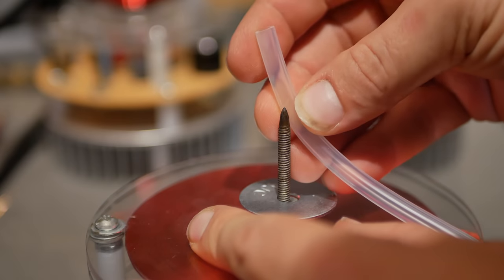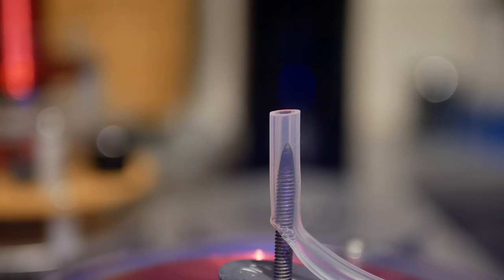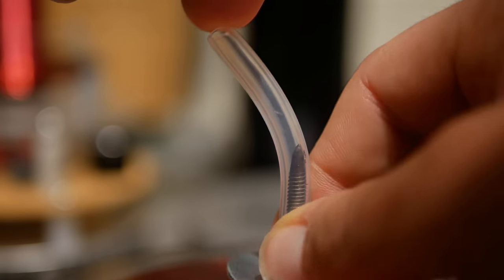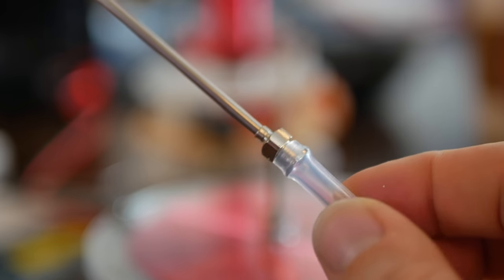My first attempt involved just stabbing the tube over the top of the coil. With the helium flowing and the coil turned on, ionized gas was coming out. Oh! Unfortunately, the gas was able to form direct arcs to my skin, which really wasn't comfortable, and I burned myself a few times. I tried adding distance between the air and the electrode, which I hoped would reduce the arcing. It actually overperformed and reduced everything. No, nothing there.